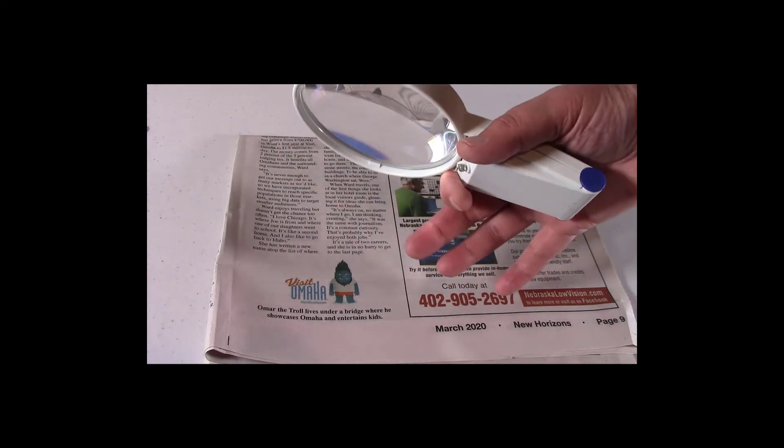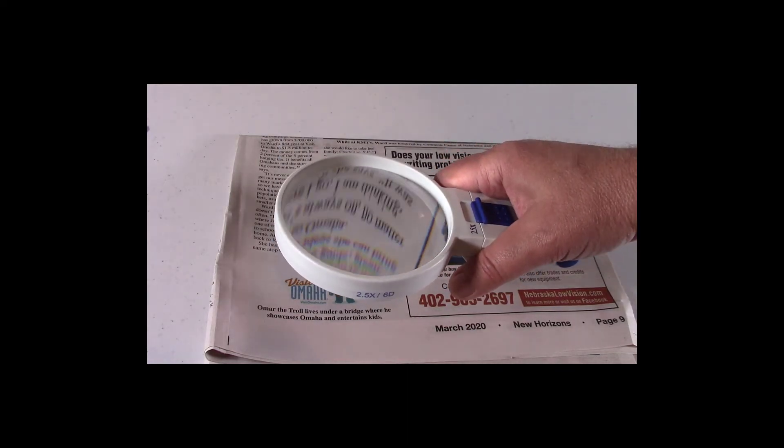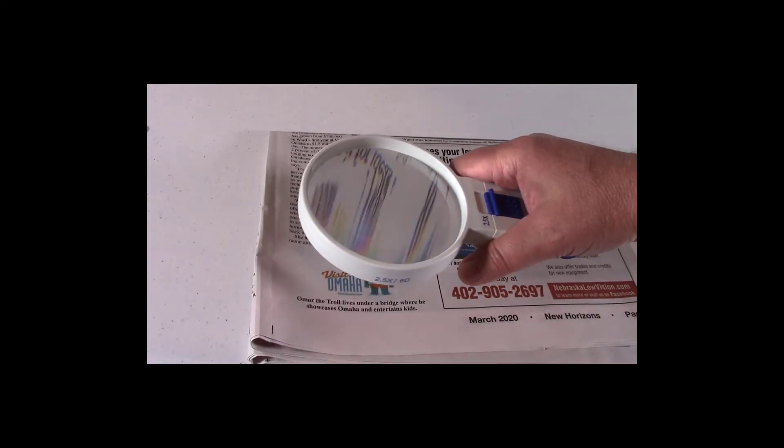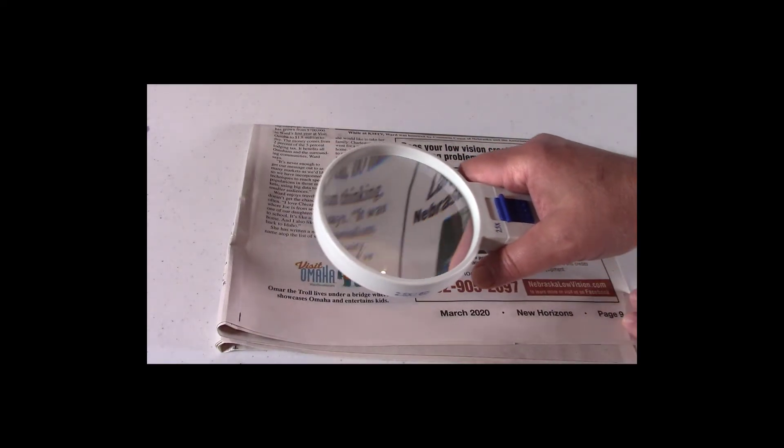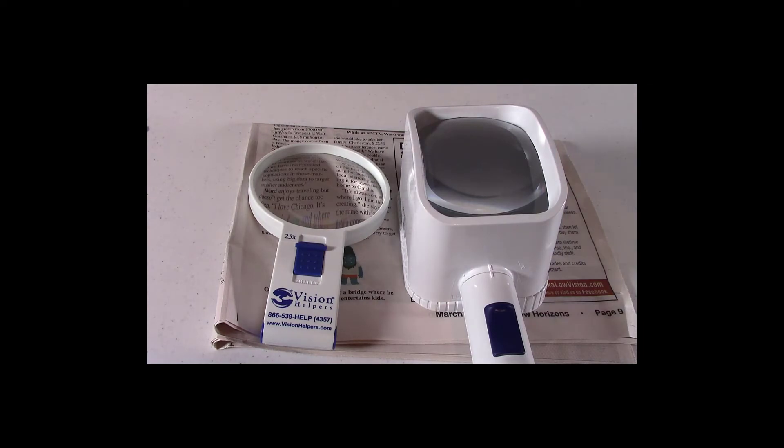A trick is to drop a couple fingers to the surface, which allows you to hold a hand magnifier steady as you read. Stand and hand magnifiers are both portable and you can carry them with you, but the hand magnifier is smaller and easier to carry in a pocket or purse.